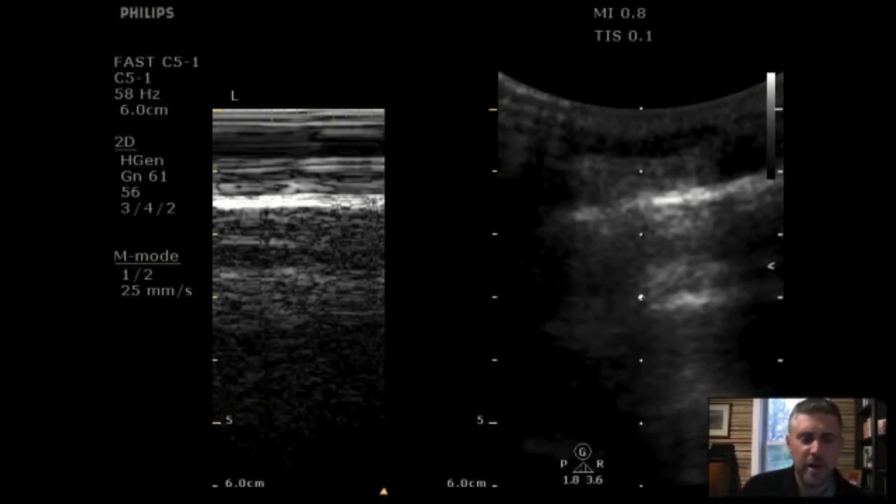And then we can put M mode on it and get that sandy beach appearance to rule out the pneumothorax at that point. If you want to rule out pneumothorax entirely, you've got to scan all the way up and down the anterior chest. But if you have a crashing patient who you're worried about a hemodynamic pneumothorax, one point should tell you that, understanding that you'll miss small pneumos if you don't do the whole thing. So that's the FAST in a nutshell, recapping and refreshing our memory.